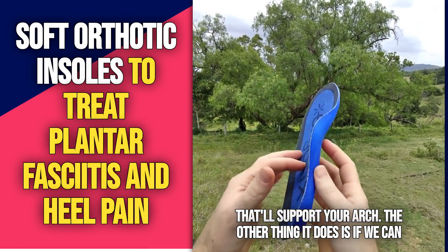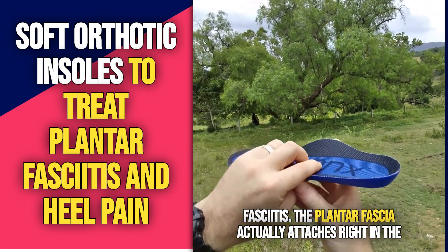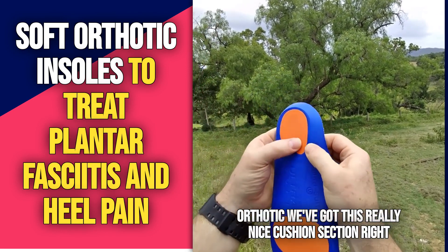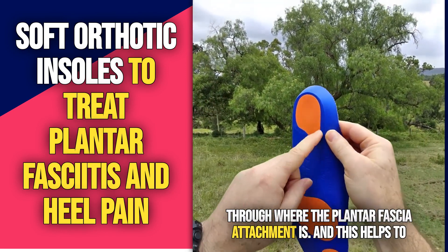The other thing it does is cushion the heel section. With plantar fasciitis, the plantar fascia actually attaches right at the base of the heel, right about here. And you can see on this orthotic, we've got a really nice cushion section right through where the plantar fascia attachment is.